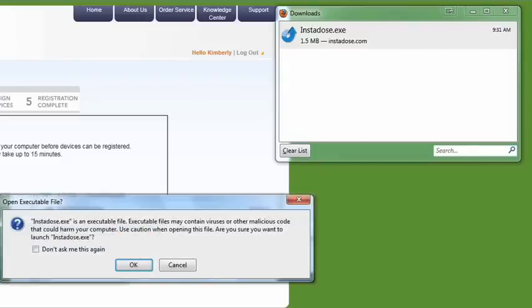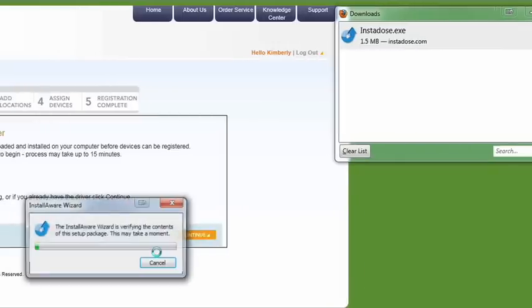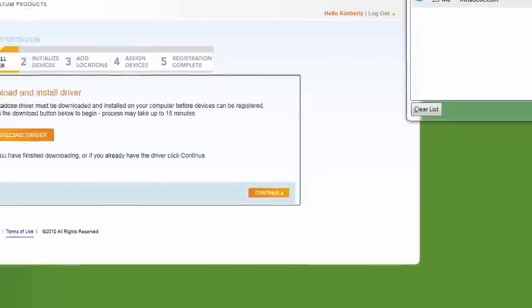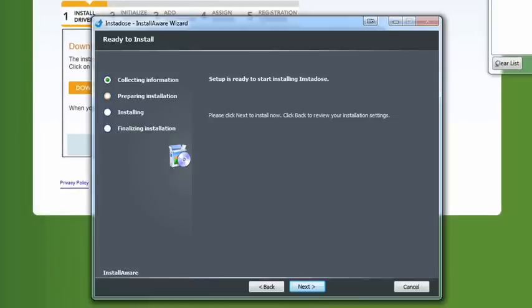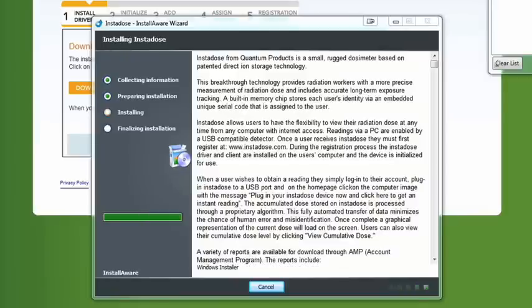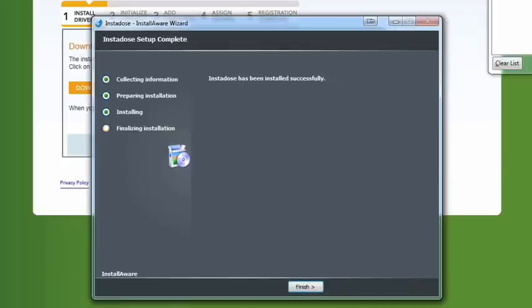A security warning message will be displayed. Click OK to continue. Click Next to install the InstaDose driver onto your computer. This process can take up to 15 minutes depending on your system. When the InstaDose setup is complete, click Finish.